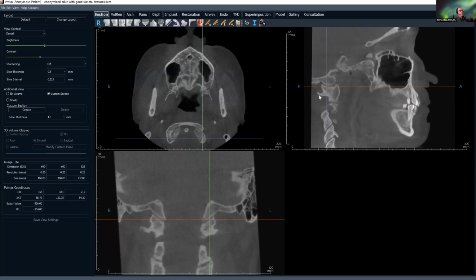And then right here, just so you see this partial formation of a ponticle. I wouldn't identify that, but you can get an idea that this can ossify into a full little loop there. So that is my scrolling through of those planes.